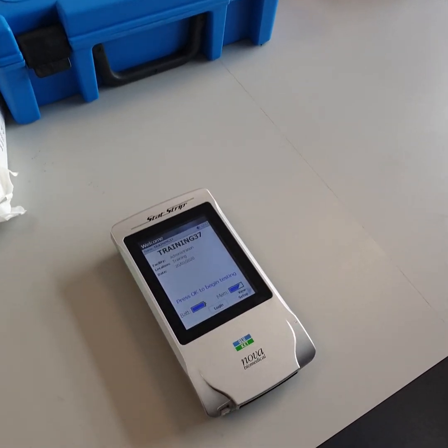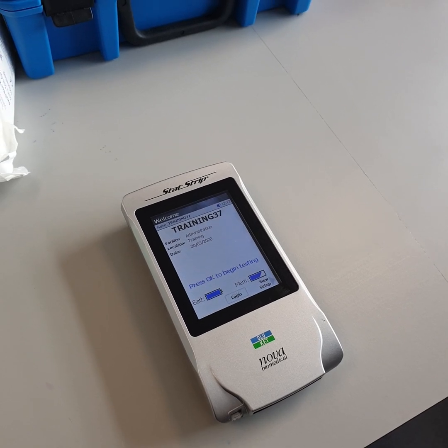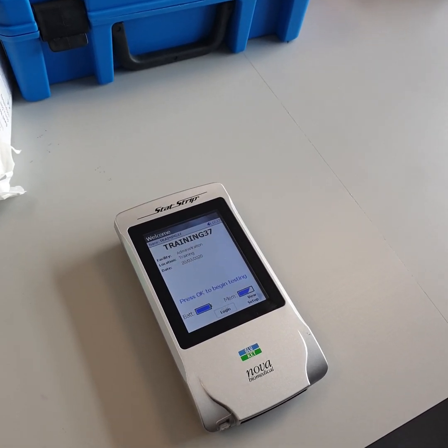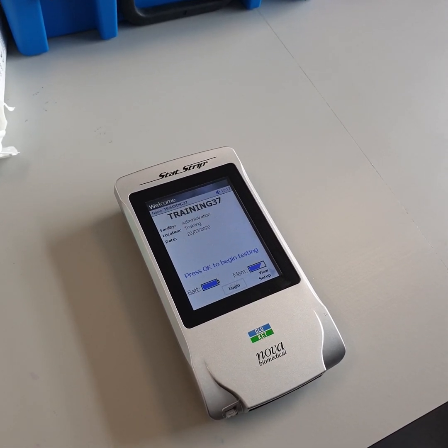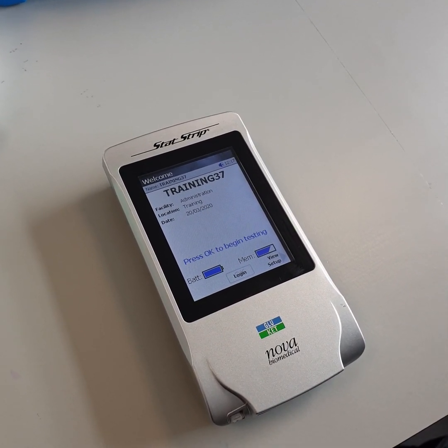Performing glucose quality control on the meter. Quality control is commonly referred to as QC. It's done every 24 hours on every meter. The meter locks out when it's due to have its QC done.